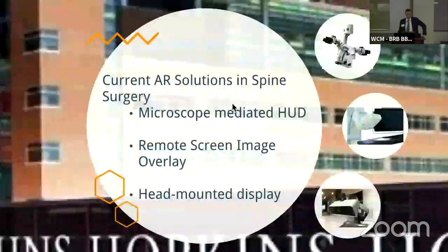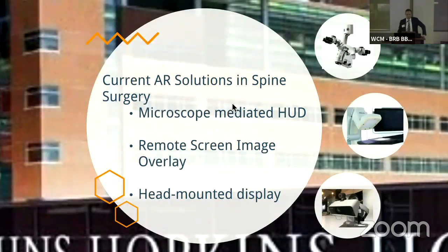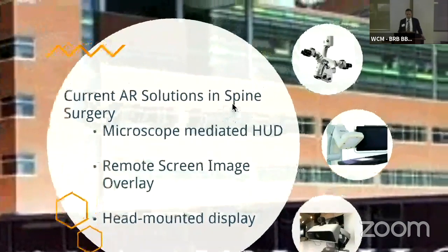So what are some of the solutions to this? Well, augmented reality could offer some solutions. There are several that are in the works already. There's a system that has a microscope-mediated heads-up display. There is a system that uses a remote screen image overlay. And then Augmedics and the xvision has developed a head-mounted display, which I'll tell you more about.